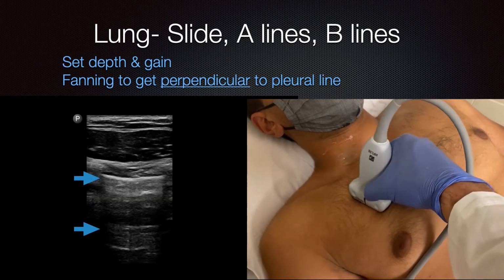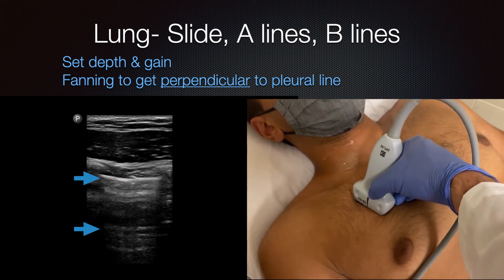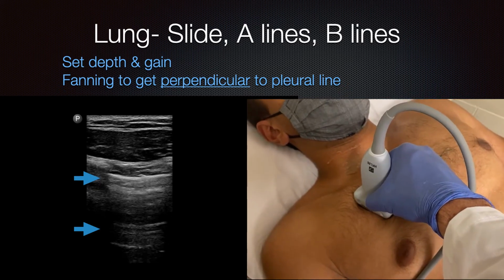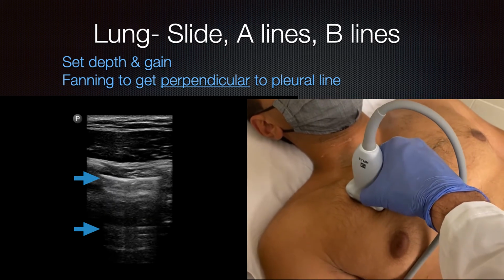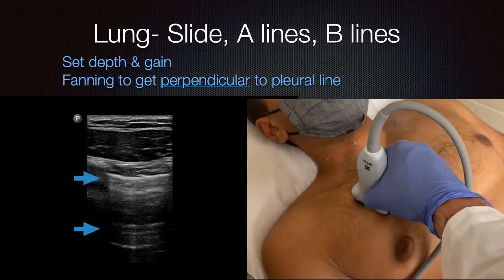Here it's deep, now it's coming to the surface. We're truly perpendicular, and below that you can see an A line down here come out. You can also see closely that the lung sliding is there, often described as ants crawling on a log. You see the parietal pleura here effaced with the visceral pleura, and the visceral pleura is sliding back and forth.